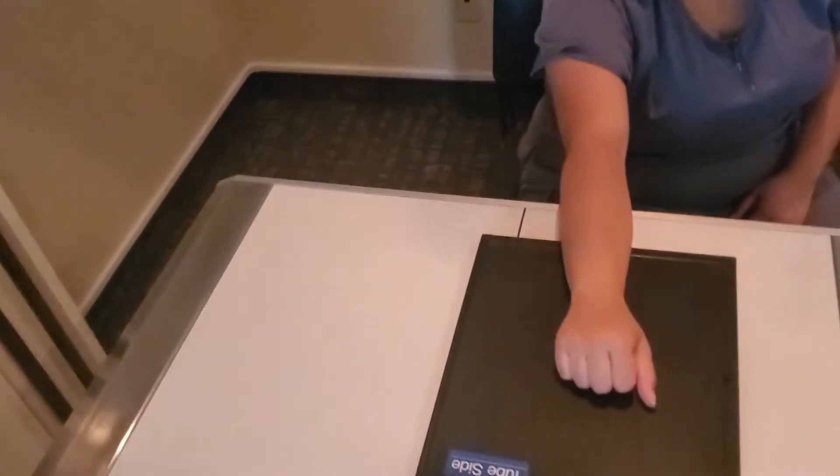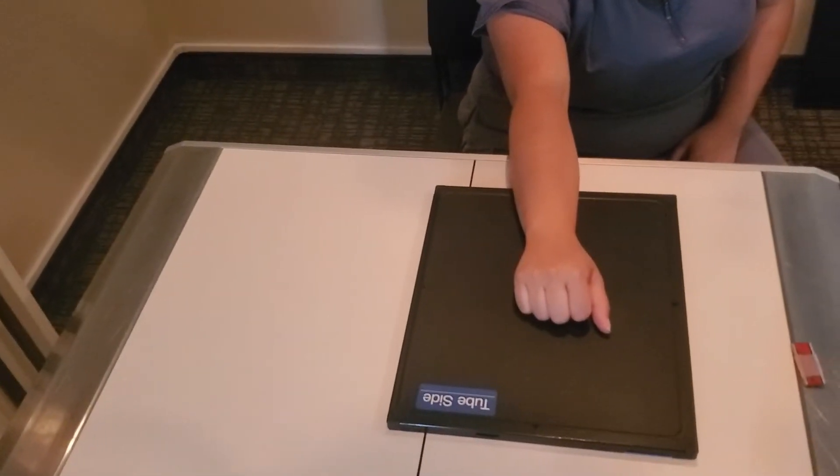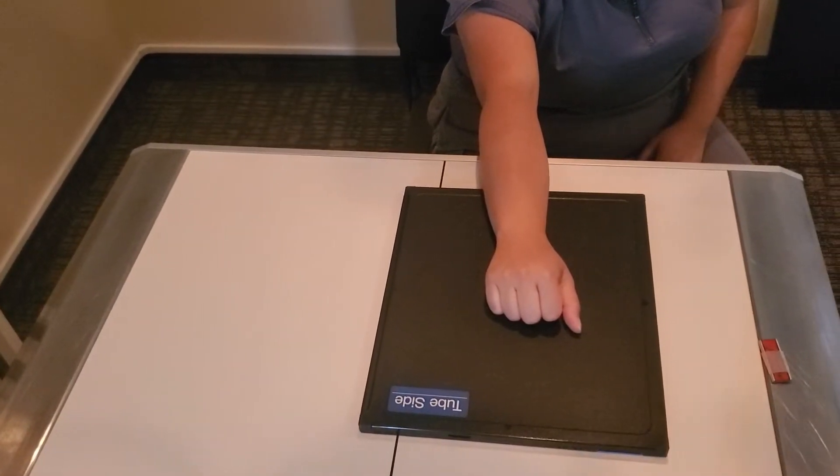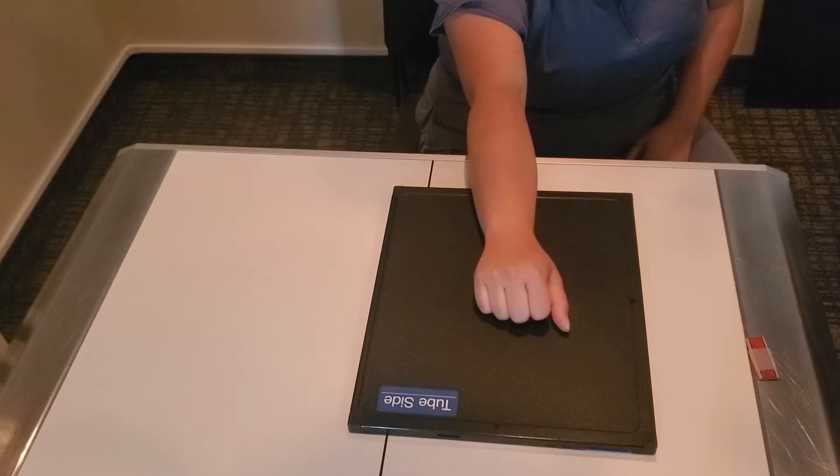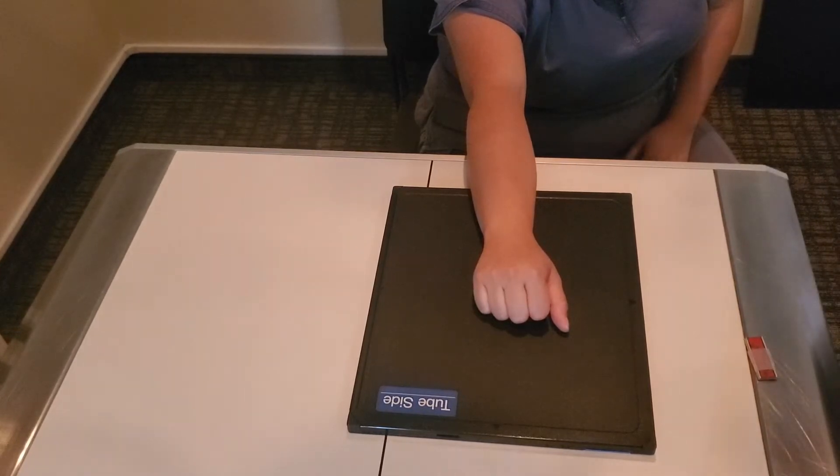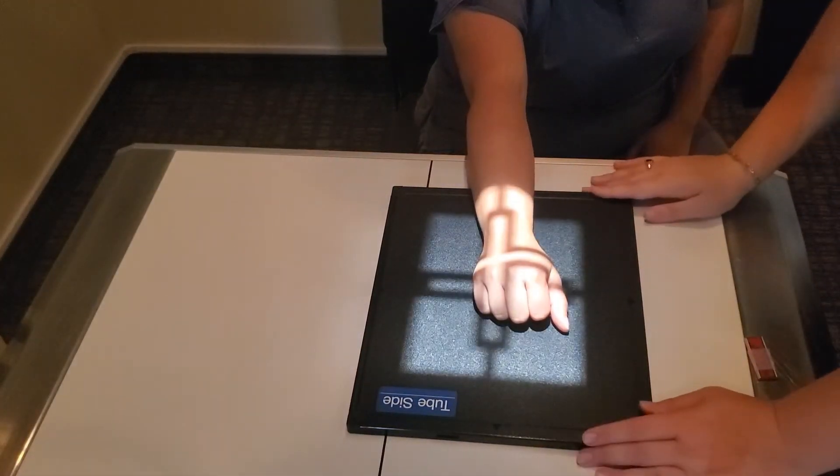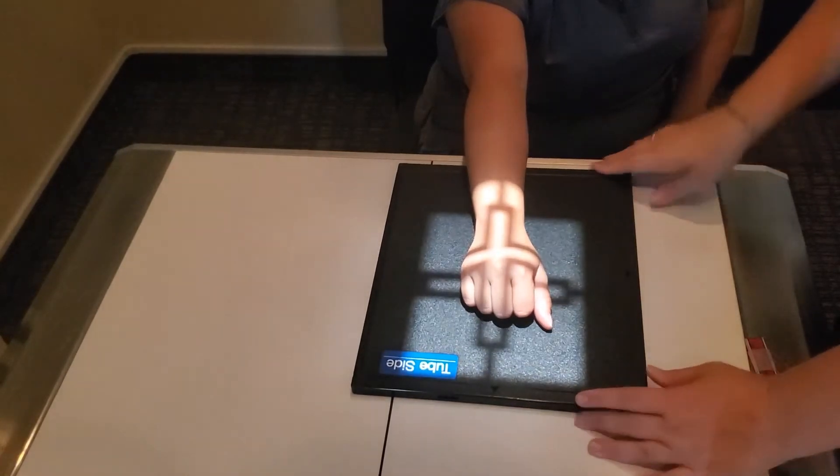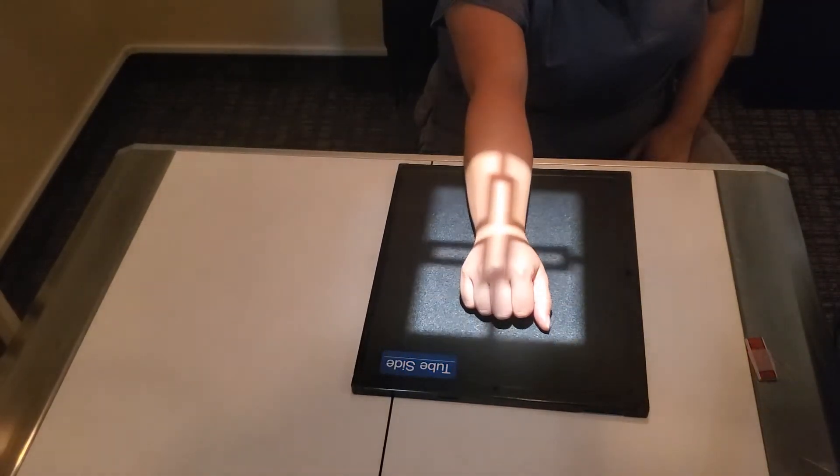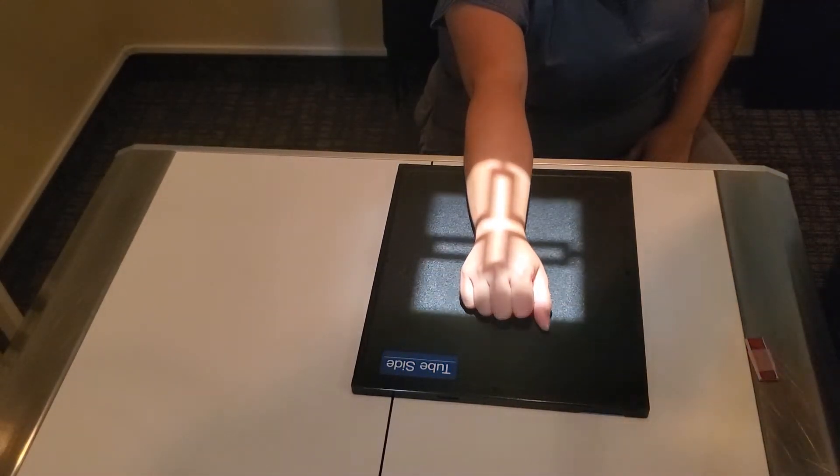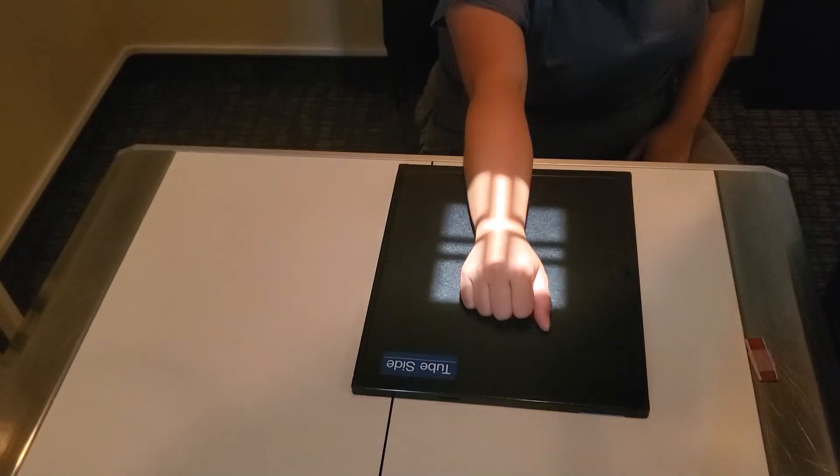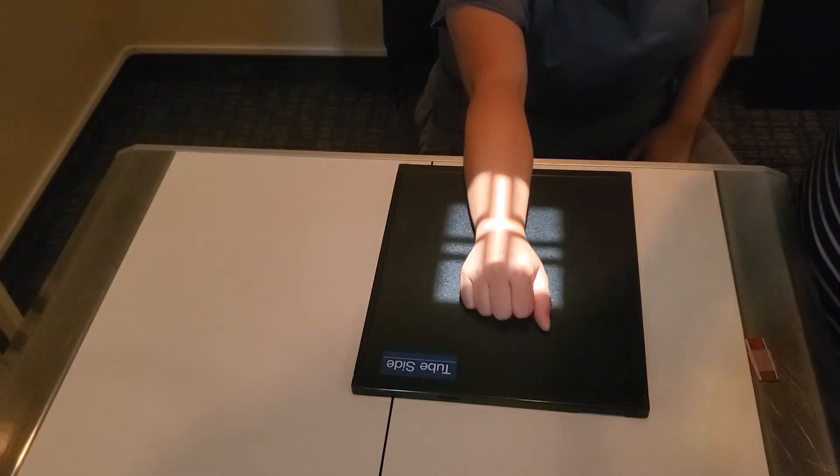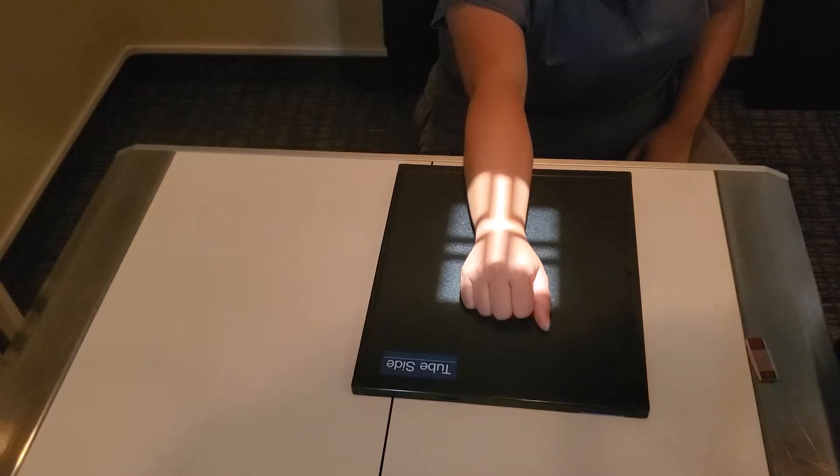So again coming up above just so you can see a little bit more clearly. This you're just centering to the mid-carpal area so there's not much fancy to it other than that hand curling. I'm going to move this down just a little, come down to the mid-carpal area. I like to include the whole metacarpal because you're supposed to get a fourth of that forearm and that usually gets that pretty successfully for you.